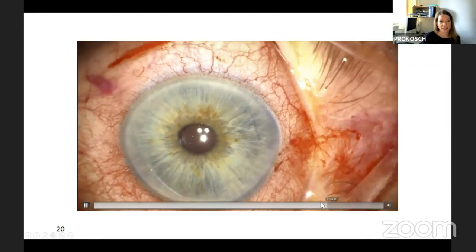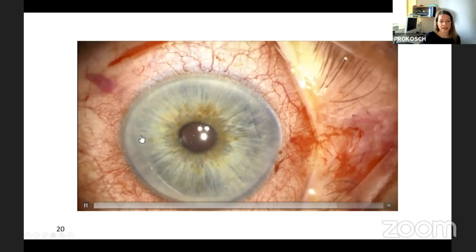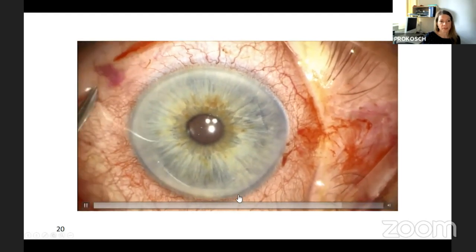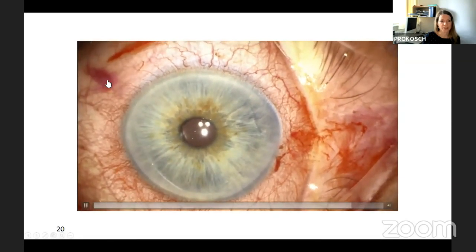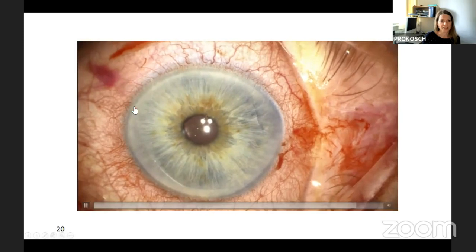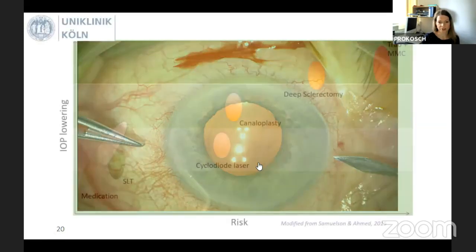You make sure that it's free and there's no pigtail. Later on, just make sure it's freed up and you don't have any pigtails. You can see it's here slightly underneath the bleeding. That's the stent, and you just wash the Healon out again.